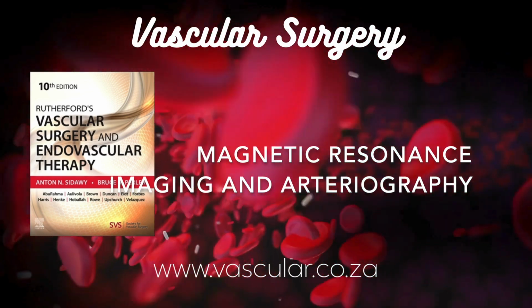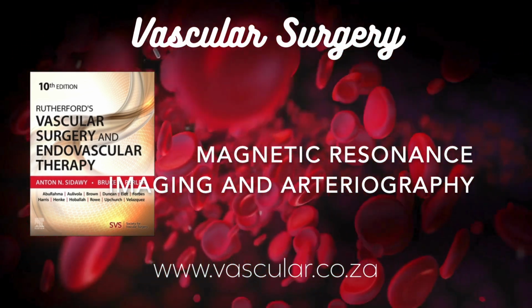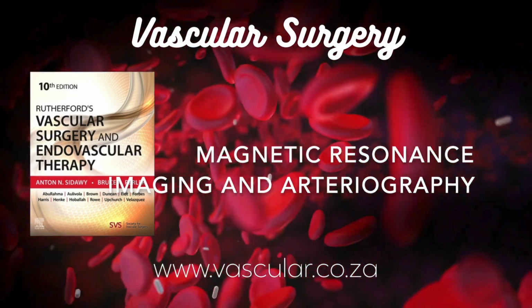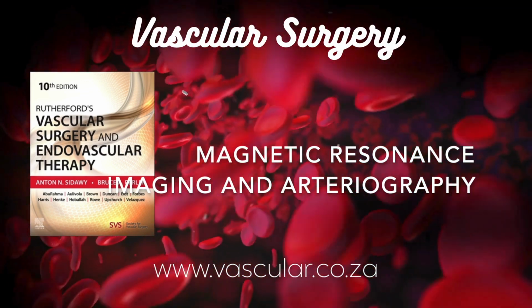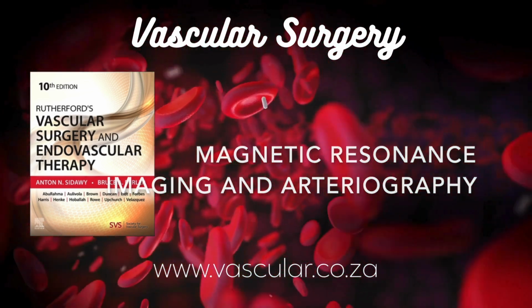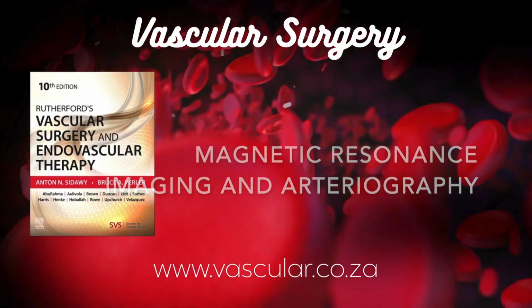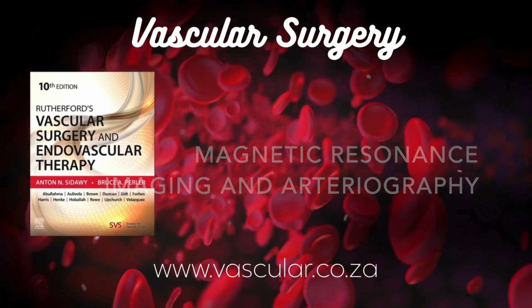The chapter lists other non-contrast methods too: SSFP, ASL, FBI, QISS. Are any of these particularly noteworthy? Yeah, there's a whole alphabet soup of techniques. SSFP, steady state free precession, is interesting because it can be very fast and provides bright signal from blood, good for both large and small vessels without contrast.